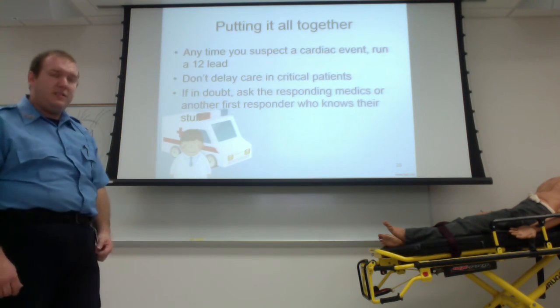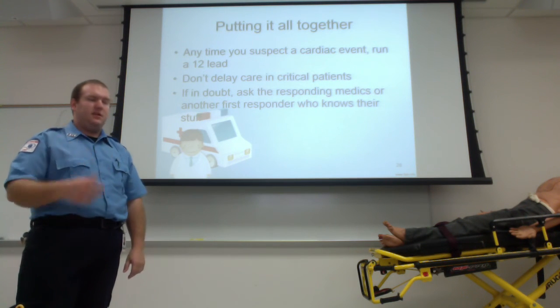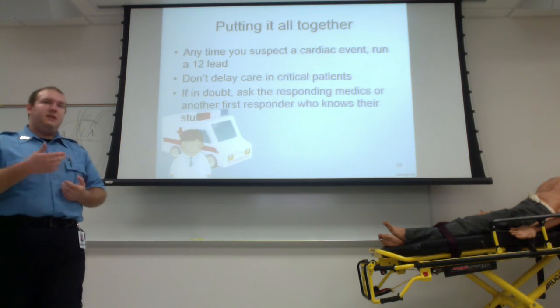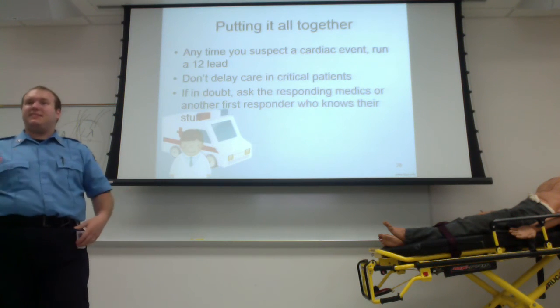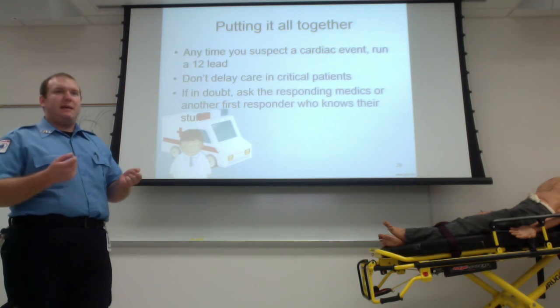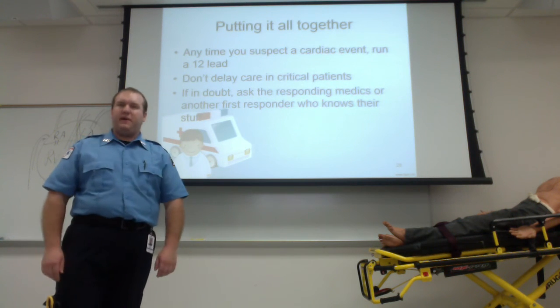Don't delay your care in critical patients, another point. If that patient is truly going on, there's the saying in EMS, treat your patient, not the monitor. Like I mentioned earlier, there's going to be a lot of imposters that look like a STEMI, but are not. If you get caught up too much on trying to figure out, is this a STEMI, is it not? You can sit there and watch your patient crashing behind you, and here you are focusing on this piece of paper, and you're not even sure what it means. So, of course, treat your patient, not the monitor.